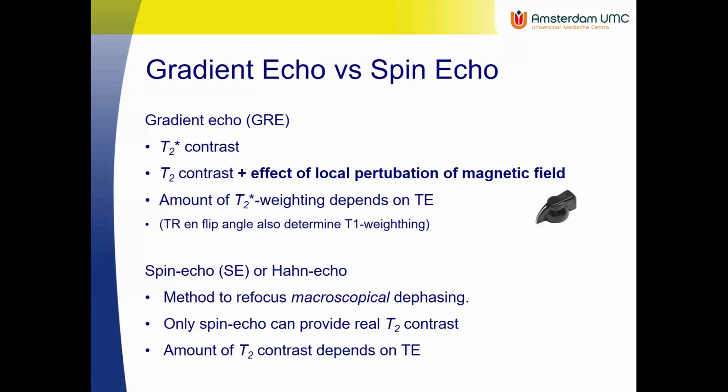And in the first example that I showed, where you have the metal wires, obviously, because of the presence of the metal wires, locally the magnetic field of the scanner is disturbed because it's maybe a bit ferromagnetic, that wire, and then you have a bit of local disturbance there. And apparently the local perturbation of the magnetic field lowers the decay time of the signal, and that's why it's dark.